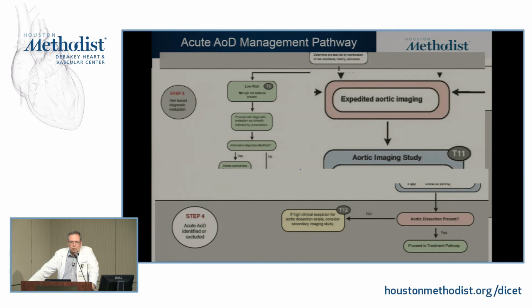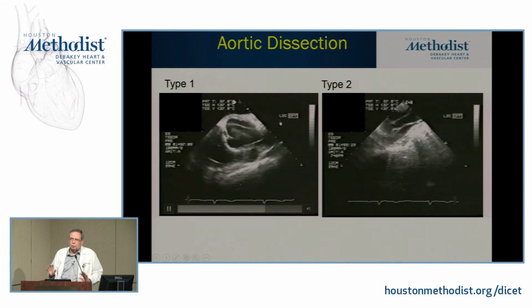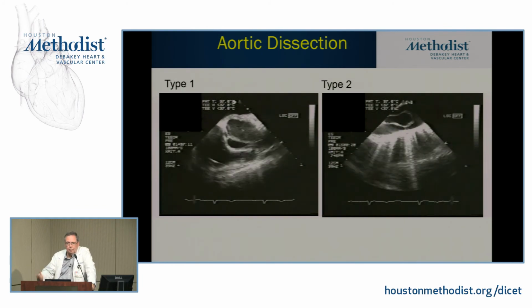But I think when you have the judgment of a good physician, you should be able to make the decision when you use these techniques appropriately. And the last session that Faisal and I did was on acute chest pain, so we went through a lot of those algorithms. So I'd like to spend a little time with you on the actual TEE, because that may be what you have.